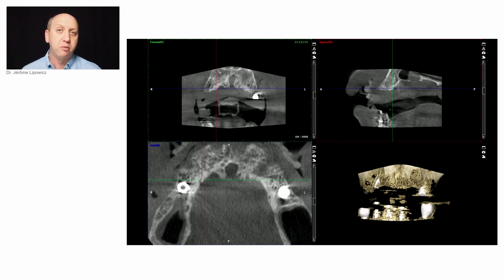Either because we are unable to distinguish hard tissues from metallic artifacts to make a good project alignment with the digital impression in the planning software, or because the soft tissue cannot be distinguished and the matching is complicated to produce a mucosal supported guide.